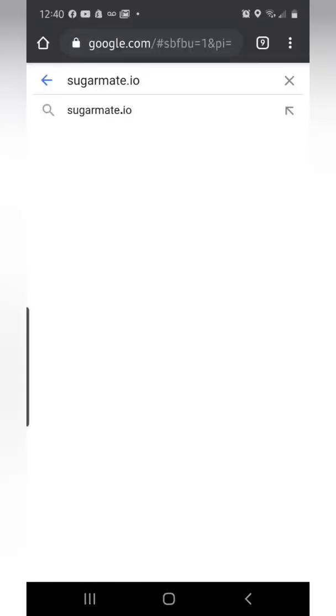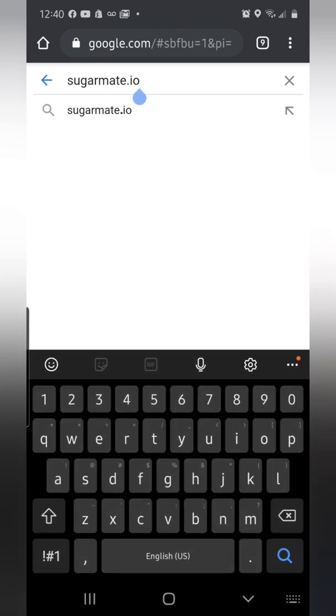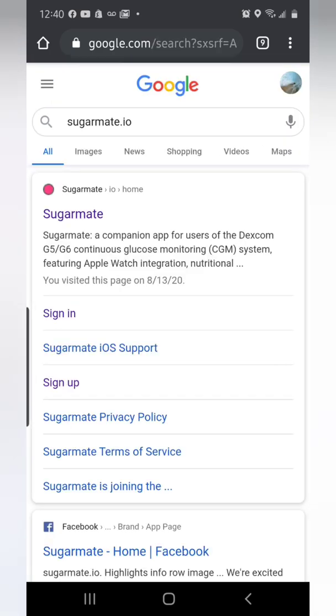What's up everybody! Here's how to get your glucose readings from Amazon Alexa — very simple. First things first, pull up a browser and type in the following web address: sugarmate.io. You can do it in the address bar up top or in a search engine.